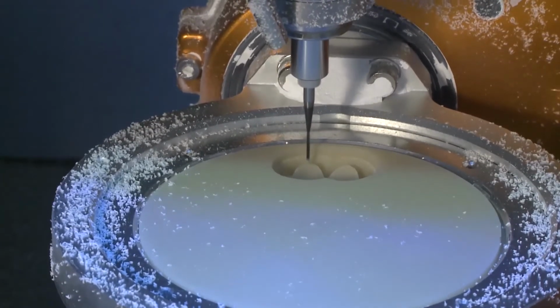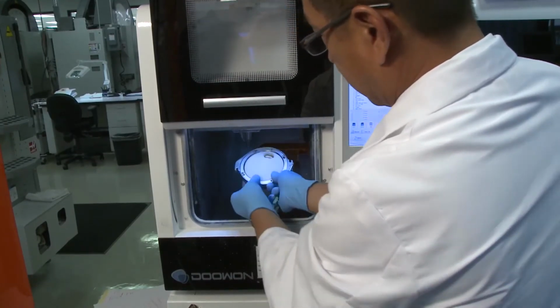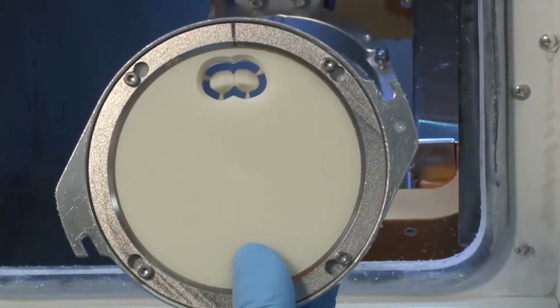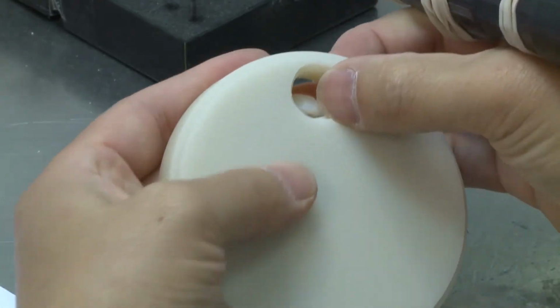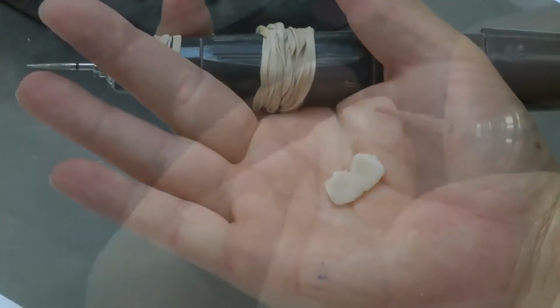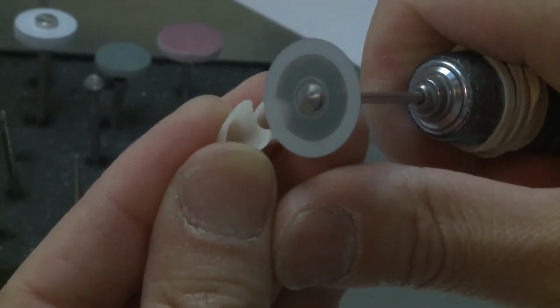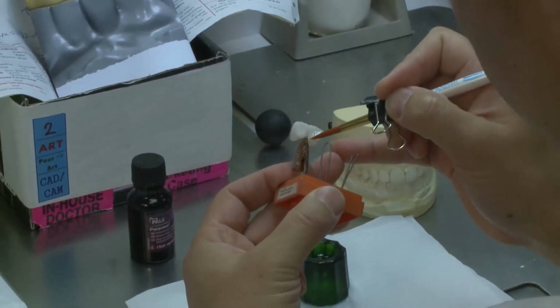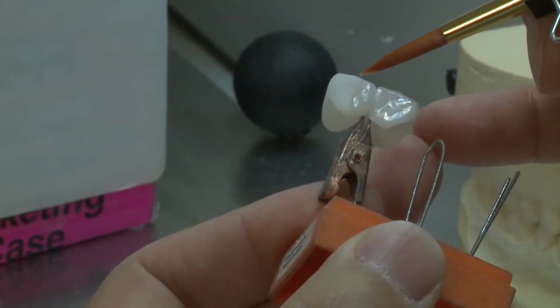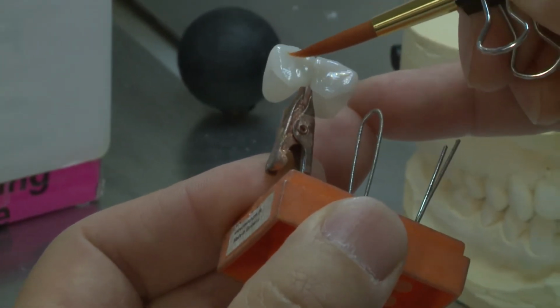So as you can see here, the milling is completed and the BioTemps is now removed from the block. Obviously, in a normal situation, you wouldn't use a 2-unit BioTemp in an entire block. So this was for demonstration purposes only. Usually, there are many different units that are nested within the same milling block. As you can see, the milling block is fairly large for just 2 BioTemps. Now, there is a little bit of artwork involved in fabricating the final product. So the technician will remove the BioTemps from the milling block and proceed with staining and glazing.